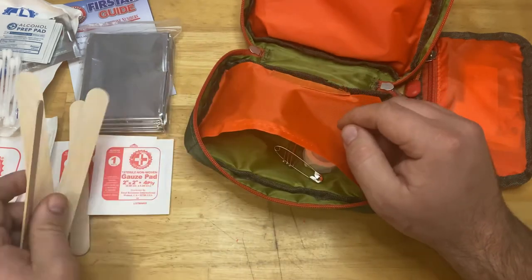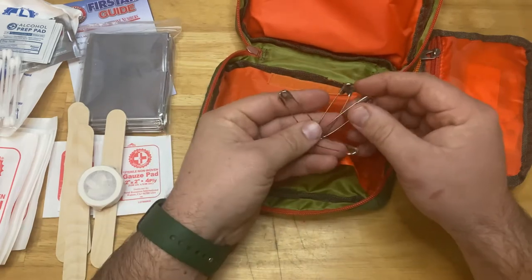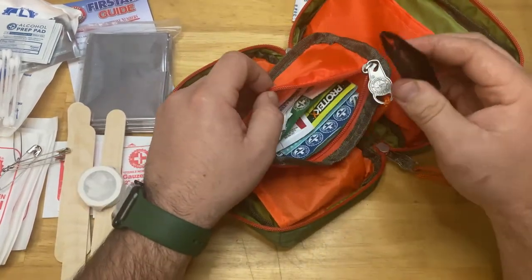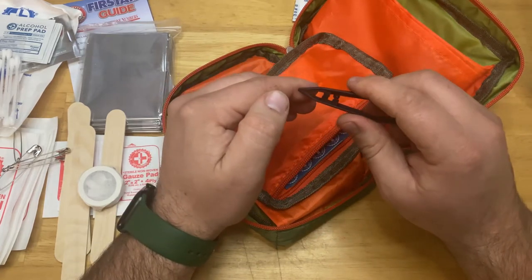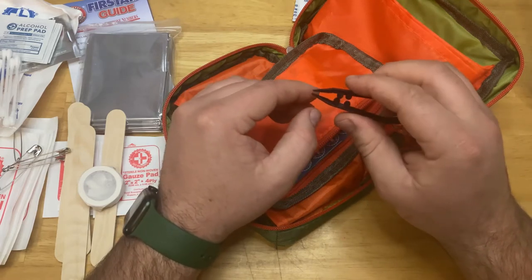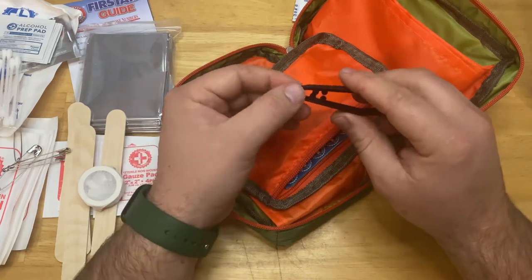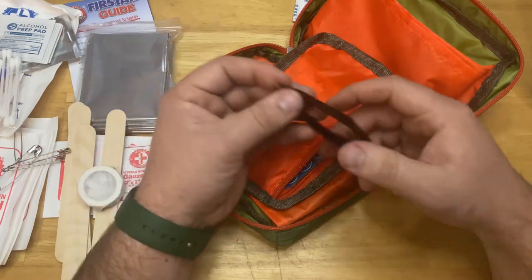There are a few more popsicle sticks, a roll of tape, and some safety pins. Let's check out the middle layer and see what's in here. We've got some tweezers — they definitely don't feel great; I can't get much of a grab with them. But if you've got a stinger stuck in you from being stung, or maybe a splinter, these will definitely come in handy.